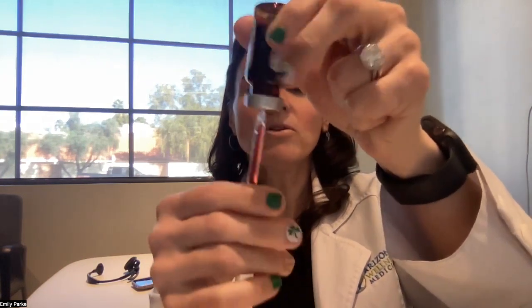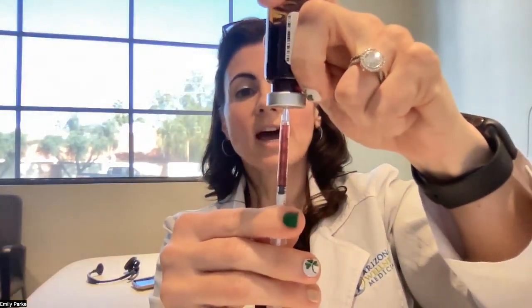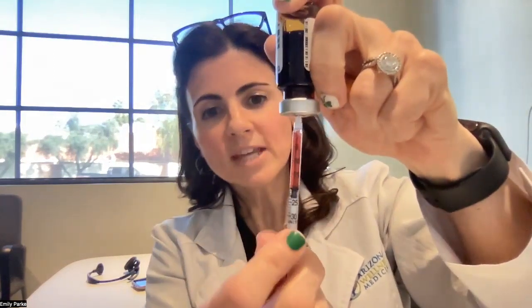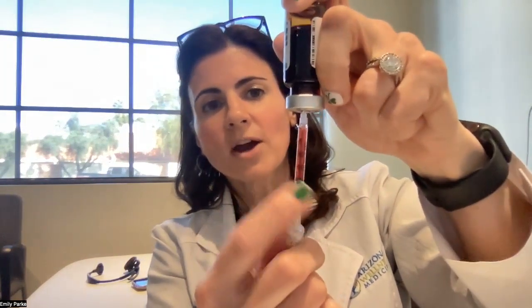If you get a bubble, one thing you can do is hold onto the vial and the syringe and flick it a little bit, and the bubble goes to the top and then you can squeeze it out. Once you've reached 20 units and you can see the black line of the plunger is at the 20 unit mark, then you've drawn up 20 units.